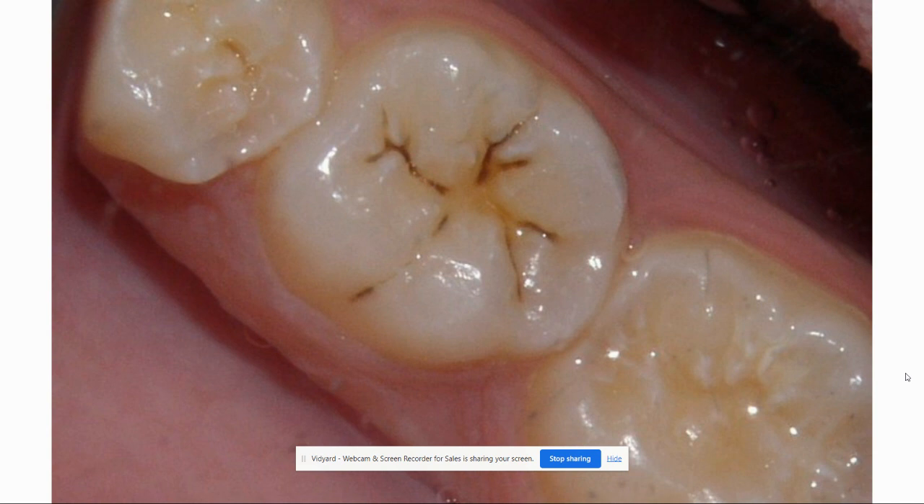So what we do is we just clean out those grooves and then I use a little special — it's called an acid etch. With my patients, I call it a shampoo. We put a little bit of shampoo on the tooth, we get it perfectly clean. Depending on what the tooth looks like, sometimes I will use my laser to get it super clean, or sometimes we'll just be able to get it clean with the dental toothbrush. After we've cleaned the tooth, then we seal up the tooth.